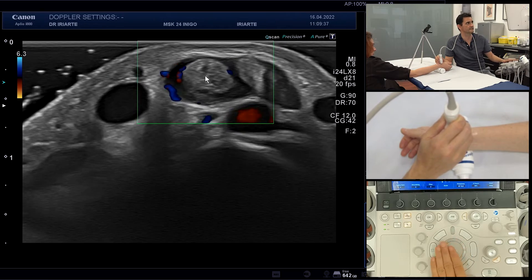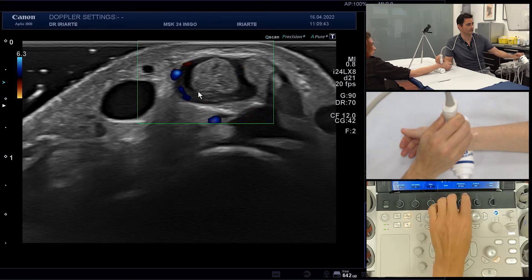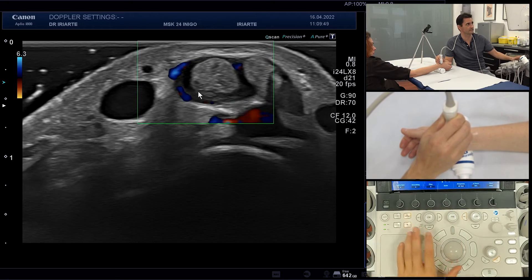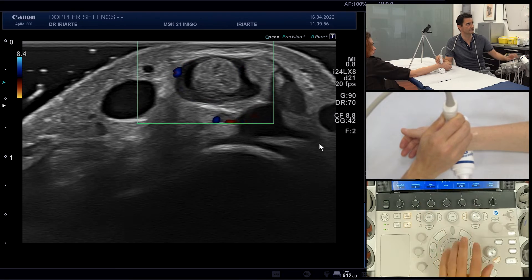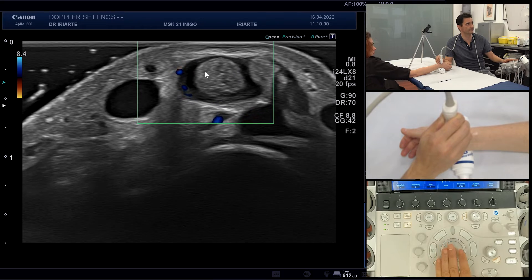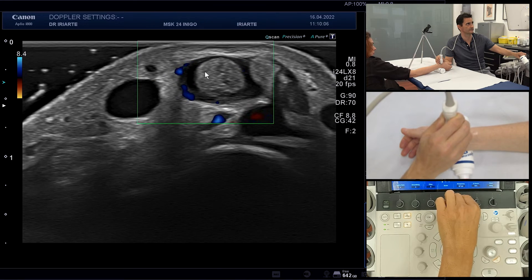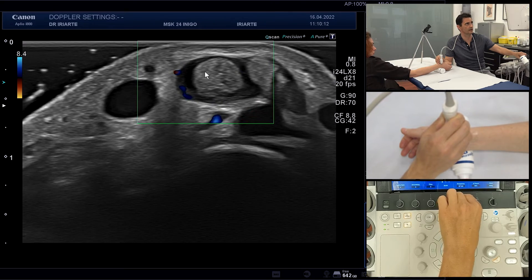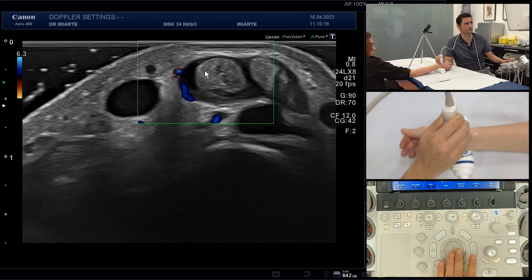For example, here we have some vessels that are somewhat superficial, and we are currently at 12 MHz frequency. Now we are going to change the frequency to 8 MHz and you see how these vessels disappear. Back to 12 MHz — these small changes are sometimes needed for a good Doppler view. Here, 12 MHz is perfect because we are very superficial.